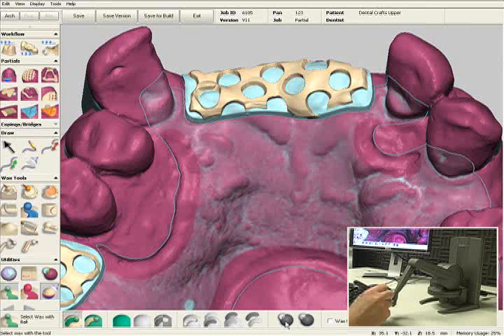As you can see, it's a very thin layer of wax — about 70 to 100 microns thick — so it doesn't really add too much space underneath your major connector. But this will give you a great fitting partial.